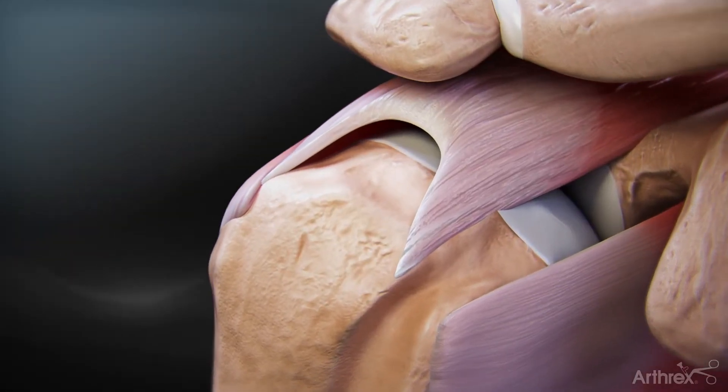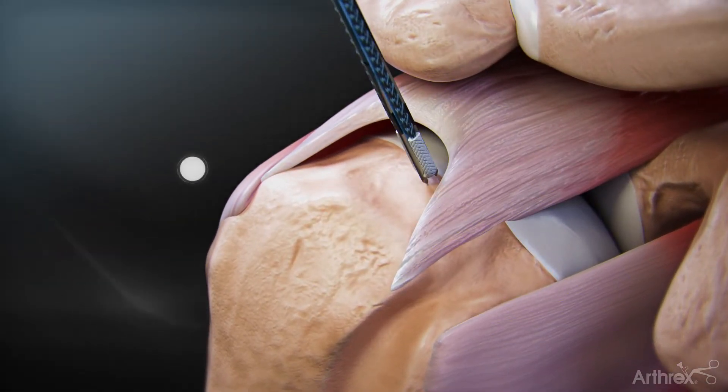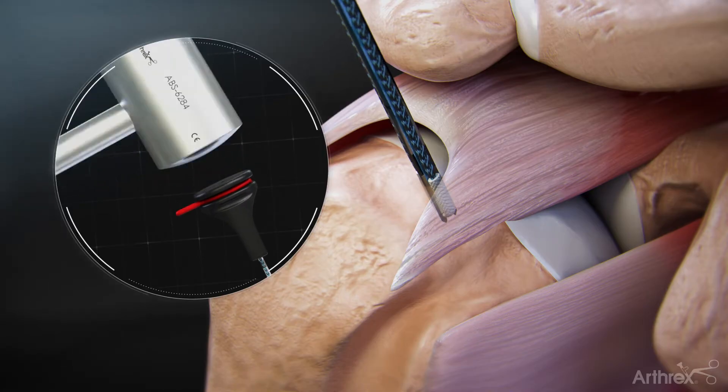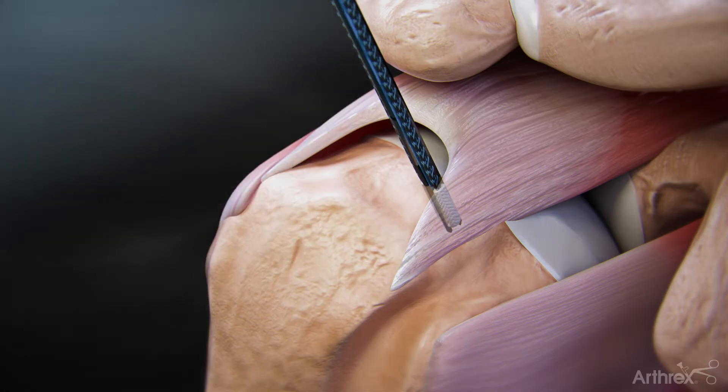Using a mallet, insert and advance the 2.6 FibreTac RC anchor into bone. If preferred, a guide can be used to aid in anchor insertion. Stop at the insertion zone laser line. If hard bone is encountered, use a punch or drill through a guide to create a socket to aid in anchor insertion.